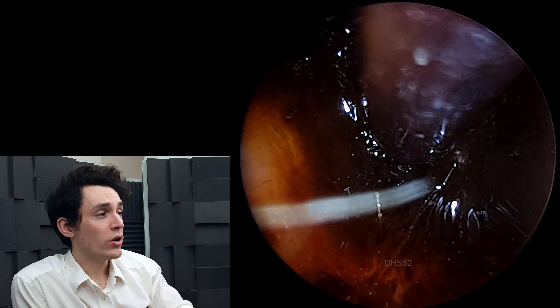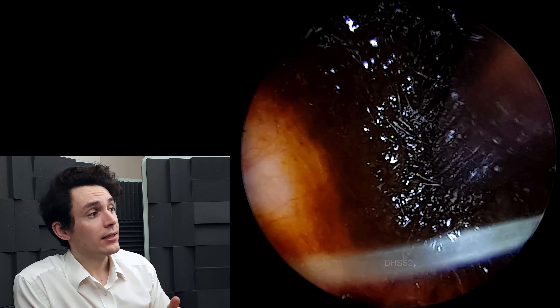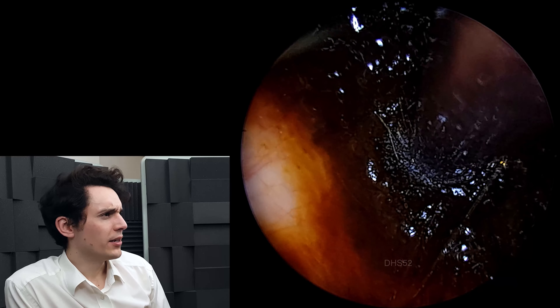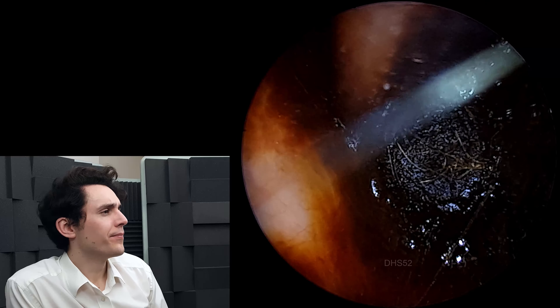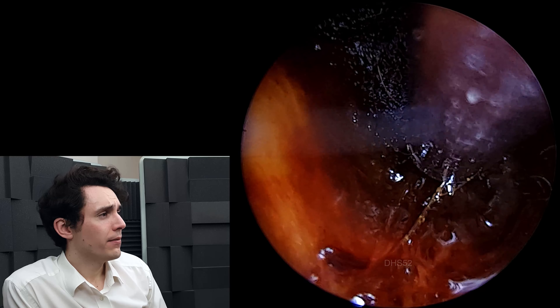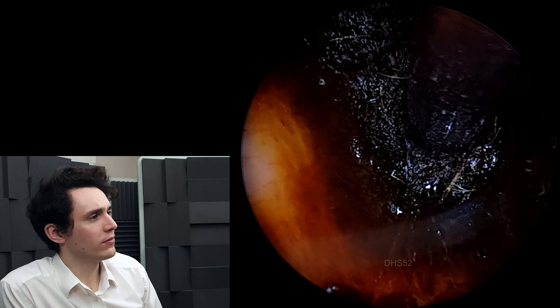So you'll see today's appointment, and then you'll see the same ear, three days later, and you'll see exactly what the effect was of that olive oil in the process. So here we can see quite a dark image. This wax is very, very dark — it's almost black, like tar. So it's had plenty of time to oxidise and plenty of time to firm up. There is some hair mixed in with the wax, but not too much — I don't think that's necessarily the root cause of the issue.